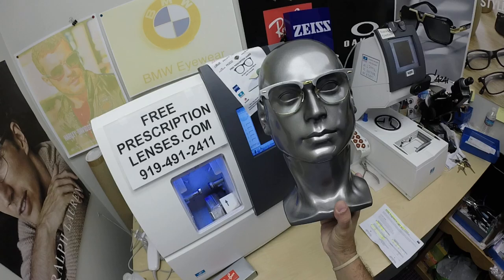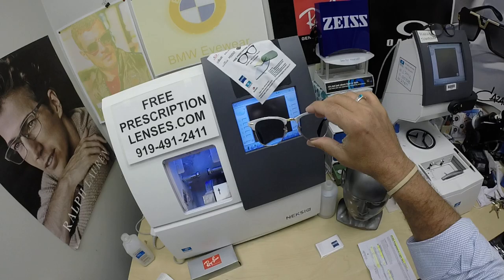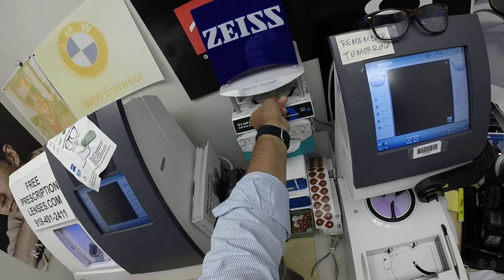So that's it, but he got them with the Zeiss Lite-D digital free-form progressive lenses. Got sawdust kicking around as I just cut these. But he got them with the Photofusion Extra Gray — the darkest gray that you can get — and the Duravision Chrome anti-glare coating. Let me show you how dark these things get and why he got them.